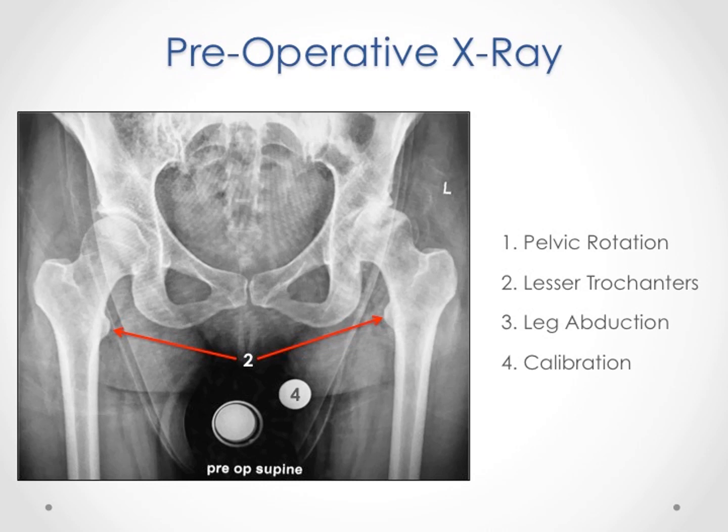First, in order to achieve a level pelvis, the operating room table is tilted left or right until the pubic symphysis winds up exactly with the spine as seen here. And then we can see symmetry of the obturator foramen as well as the teardrops. So now we have a neutral pelvis.